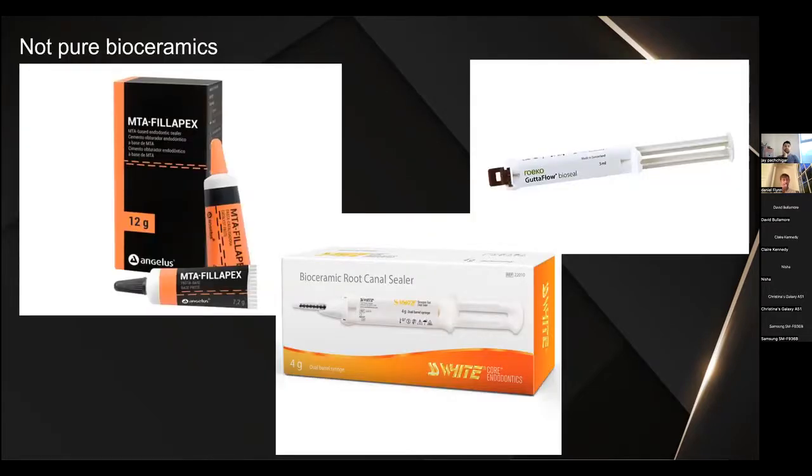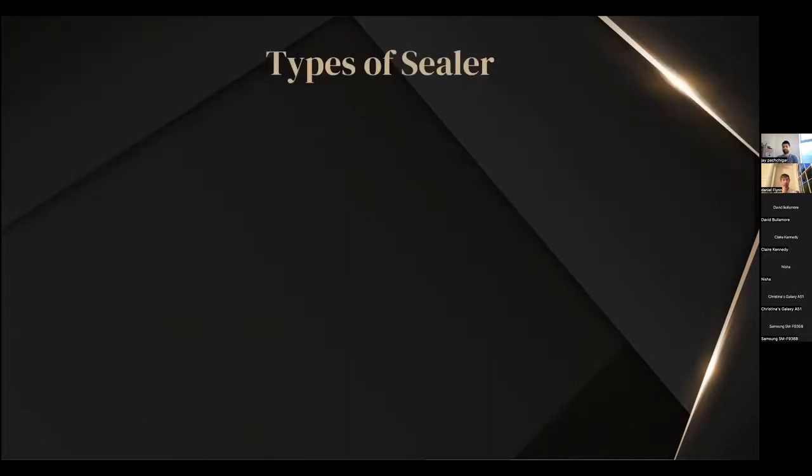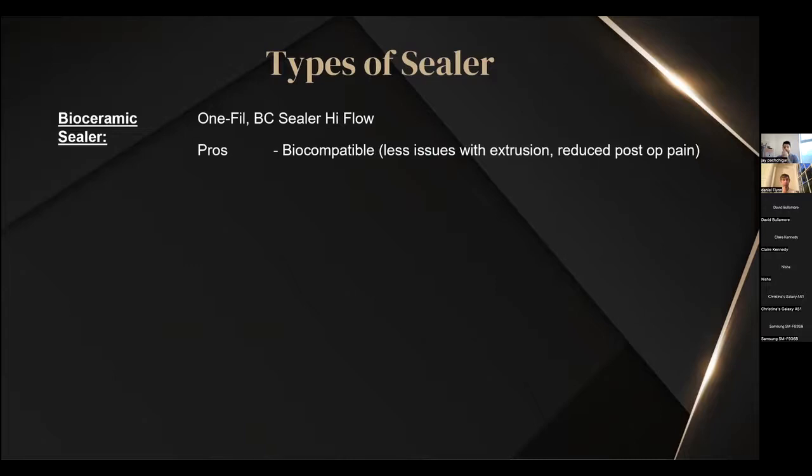So you do have to be careful if you are switching to bioceramics, because some sealers are marketed as bioceramic sealers, but a lot of them are bioceramic and resin based, with only maybe 10-15% bioceramic. So the hope back then was to get the best of both, and unfortunately it didn't quite turn out like that. So the bioceramic sealers, they are very biocompatible. I definitely wouldn't say there's no issues with extrusion, but there is certainly very minimal, reduced post-op pain with the extrusion of just the sealer alone.